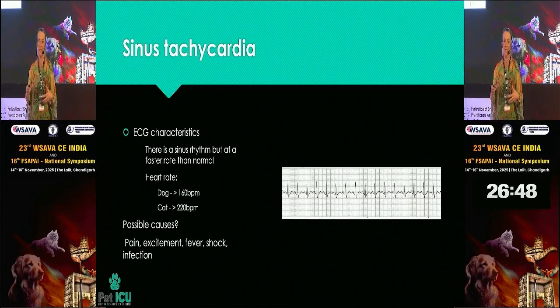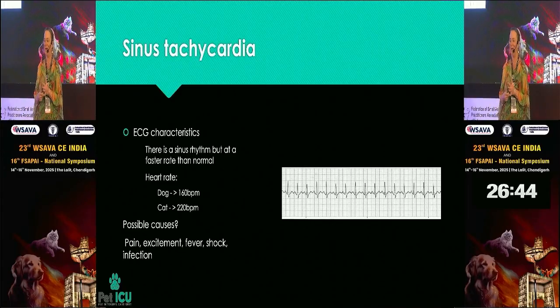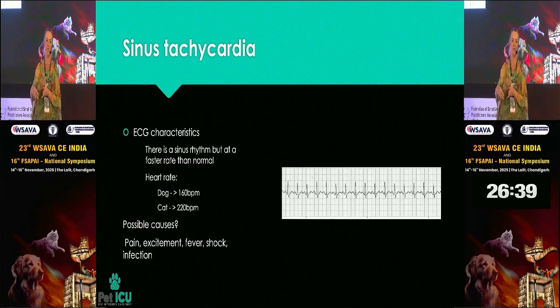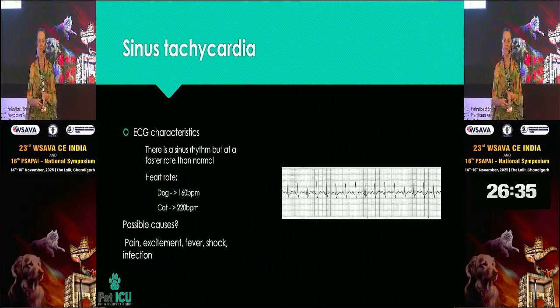The sinus tachycardia, if we're seeing this, we're thinking, right, I'm in ICU, are they hypovolemic? Are they painful? This is persistent tachycardia, not just transient. And you're looking for underlying causes. There's normally something going on for them to be this tachycardic.